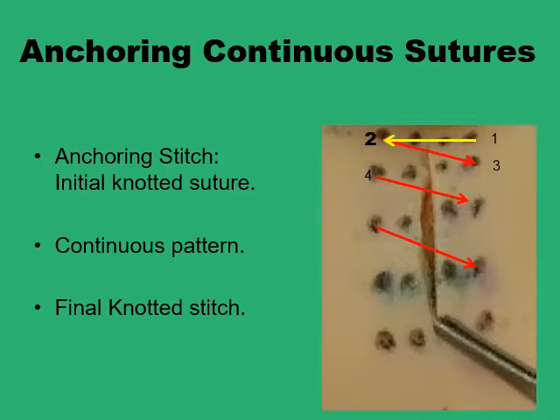Continuous sutures are made up of units of sutures that move continuously between one level and the other. These units are formed mostly of either horizontally oriented or vertically oriented patterns. Sometimes there is a mix, a hybrid between the two. So for example, in the simplest form of continuous sutures, the pattern goes on from 2 to 3 and from 4 to 5 and from 6 to 7 diagonally on the surface and horizontally in the tissues.